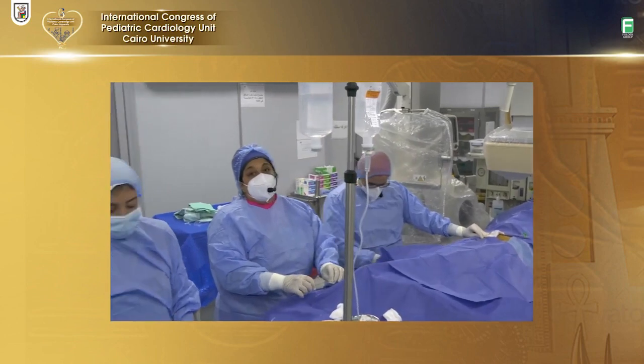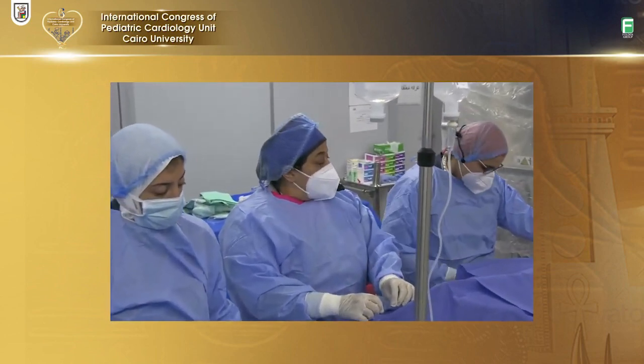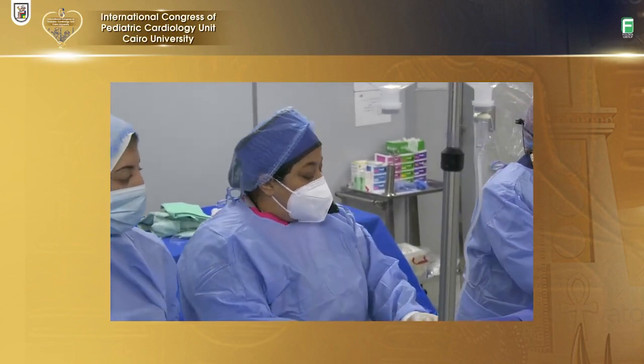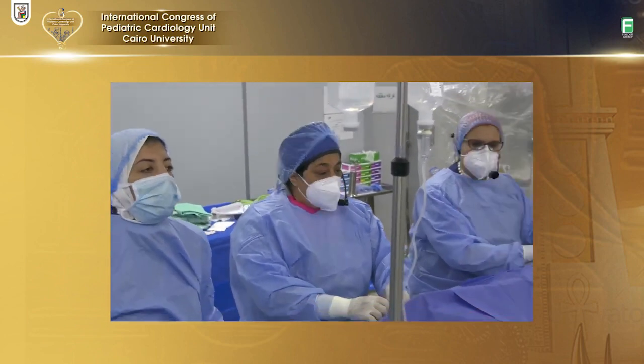Now we're using a 6 French catheter, multi-purpose end inside, and we're introducing it over a wire.